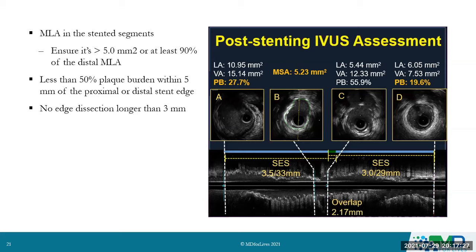The longest stents commercially available in the US right now, well, there are some 48 millimeters, but those aren't widely available, so 38. I go back in then and I post-dilate again at high pressure with the NC balloons that I used to pre-dilate, and then I repeat my imaging. As I'm going in, if I'm using a catheter with what's called chromaflow or the ability to do power Doppler, I'll power Doppler when I go in to look for edge dissections and side branch flow.